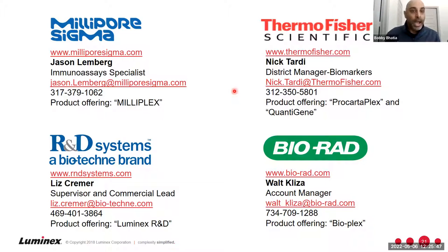The answer is no. You have to understand that when it comes to traditional immunoassays, each of those companies that you purchase ELISAs from has their own unique standards. They have their own unique capture antibodies, their own unique secondary antibodies, their streptavidin, and biotinylated detection antibodies. Every company has validated their own unique standards and their own unique secondary antibodies based on the titers and what works and what doesn't. However, you should hopefully find that trends do stay the same. If you expect an LPS-treated sample and you're seeing cytokine stimulation, odds are you will find cytokines being stimulated by LPS running these assays.